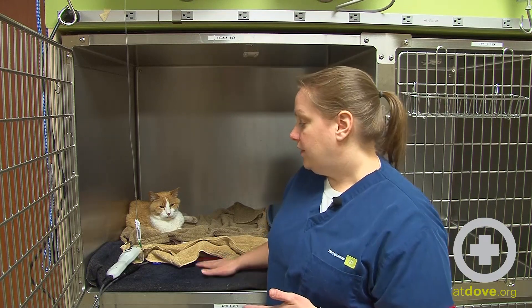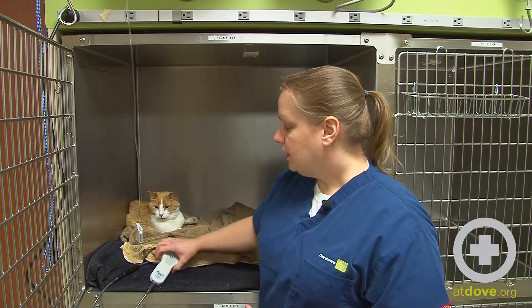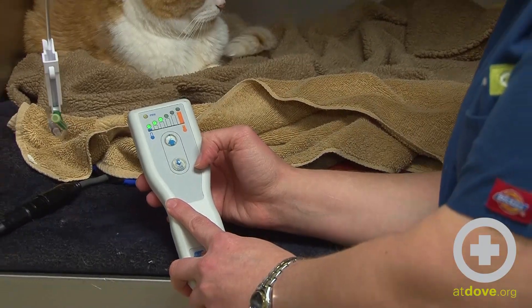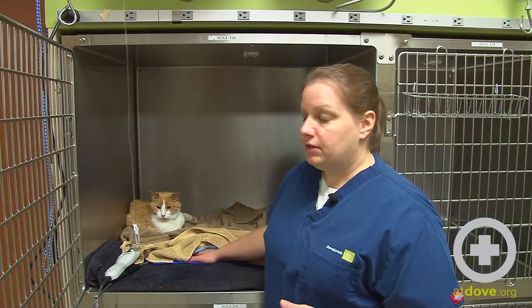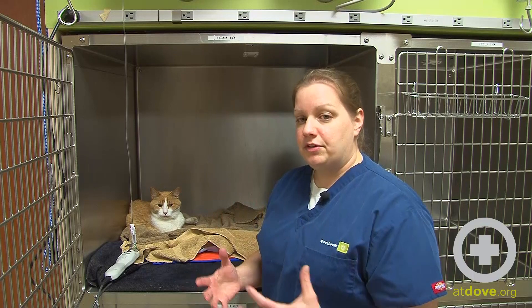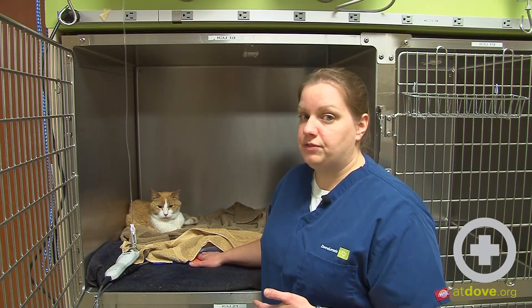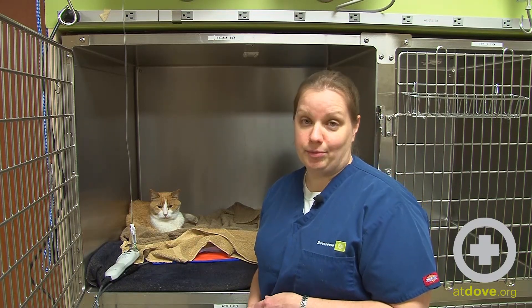There's the hot dog warmer, and then this here is called a chill buster. These have a way that you can set the temperature, and in this case we've put it under some blankets. They are made so that they don't get so hot that they burn the animal, but they are providing a source of heat that the cat can't necessarily crawl away from. Most cats also don't like to be covered when they're cold, so we definitely want to avoid stressing the patient out. If we can get him to lie on a warm surface and keep his temperature up that way, he is happy and we are happy because we have his temperature in a normal range.